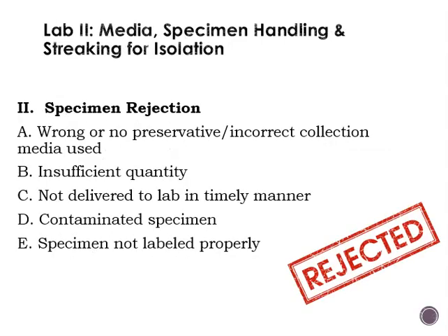Okay, so some tips for specimen rejection. If the wrong preservative or collection media is used, say a wound culture is collected and they collect it on a throat swab that doesn't have a preservative in it, that might be reason for rejection.